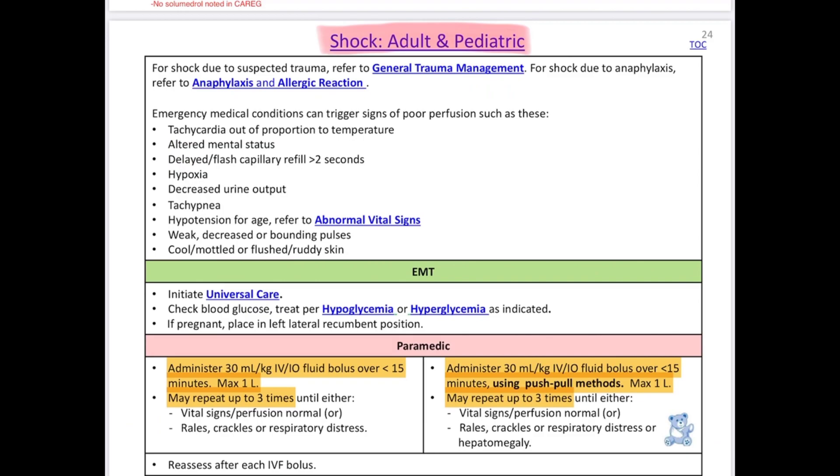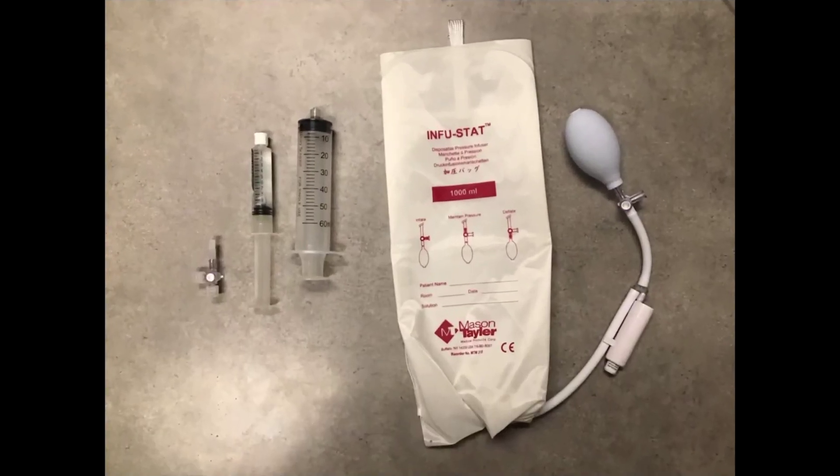Volume takes a while to get in, so if you have a patient who's hypotensive and they need volume, we're going to have to get it in quick. My favorite technique is to use the pressure infuser bag. Here we have the pressure infuser and a couple different syringes we can utilize with the stopcock. You don't need the stopcock — there's another way you can go directly in the line.